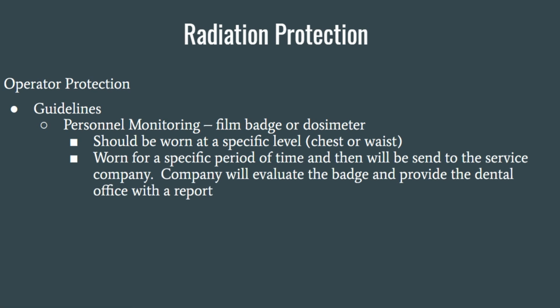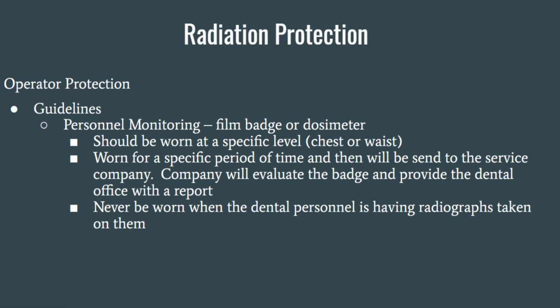And that badge is also worn for a specific period of time, and then it's sent back to the company. The company will evaluate the badge and then send a report to the office telling you who got exposed and potentially how much exposure and to where they were exposed. It's important to pay attention that if you are the dental personnel who works in the office and you are having your teeth cleaned for the day, so you're getting x-rays taken or something, make sure you take it off. It should never be worn when you are exposed to the radiation as a patient.